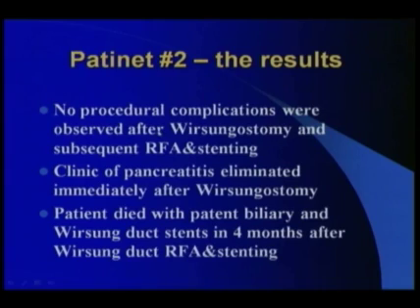So, results. Again, no procedural complications were observed on the wirsungostomy or after the wirsungostomy procedure and subsequent RFA processing and stenting. Clinic of pancreatitis has been eliminated immediately after the wirsungostomy procedure. The patient died with patent biliary and Wirsung duct stents 4 months after Wirsung duct RFA and stenting.